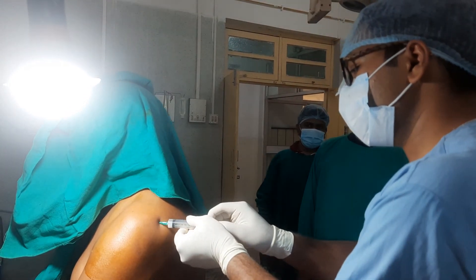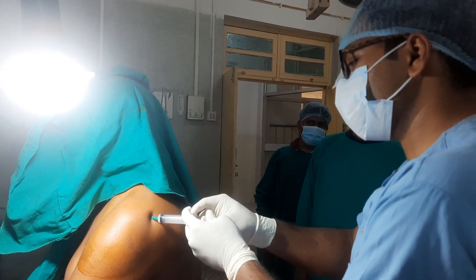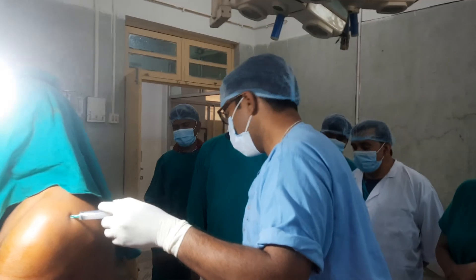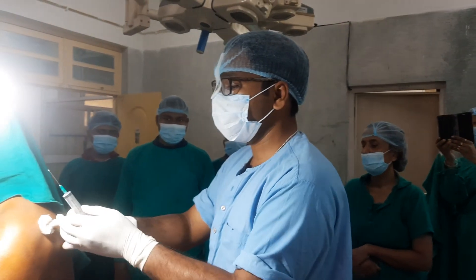The full cocktail has been gradually delivered into the subacromial space. Now it is just a matter of applying a sterile gauze and dressing.